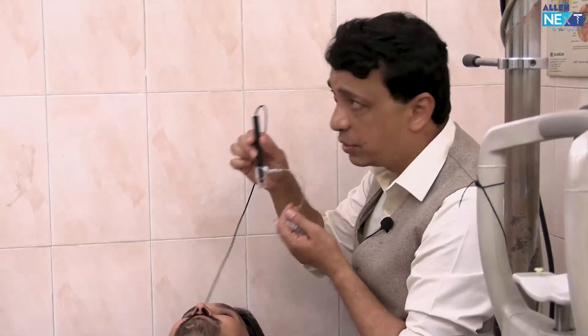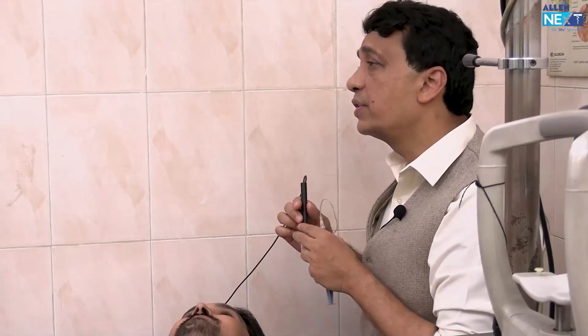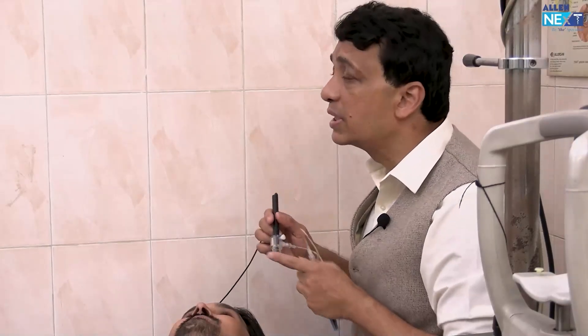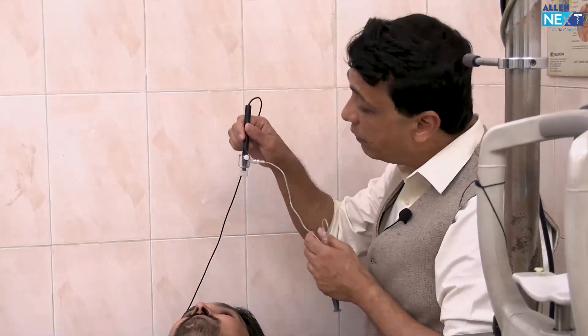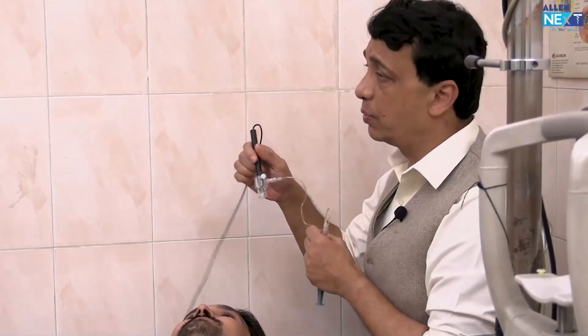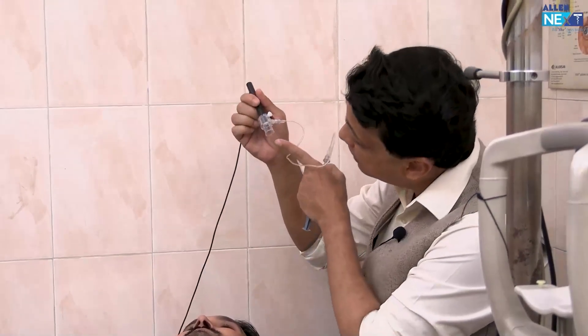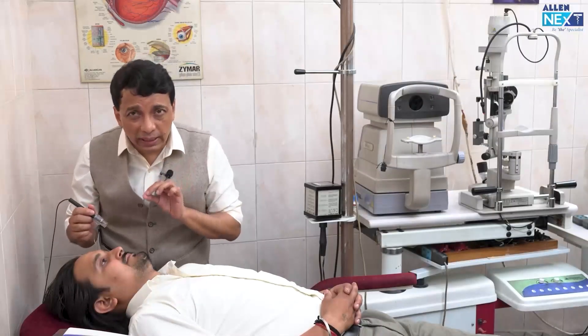Remember the two things that are important in immersion: first of all, there is no compression; but second, sometimes even if you rule out the compression, what might happen — you have to be careful — is that it is not on the visual axis. So that is what the patient has to be asked to look at: the fixation light, which is at the center here.